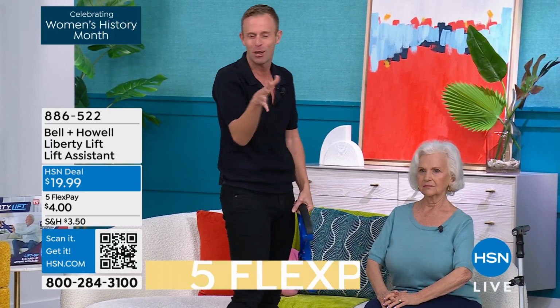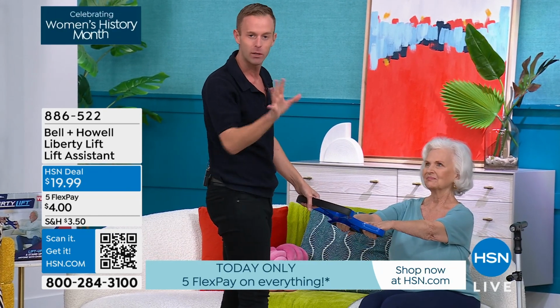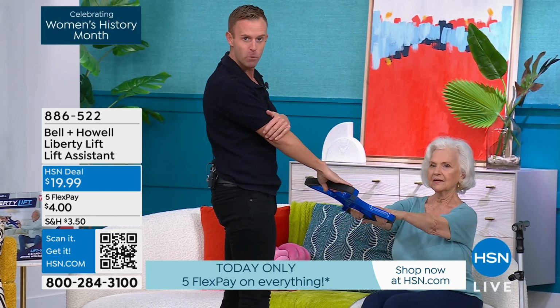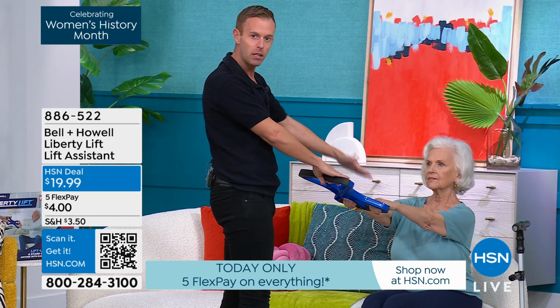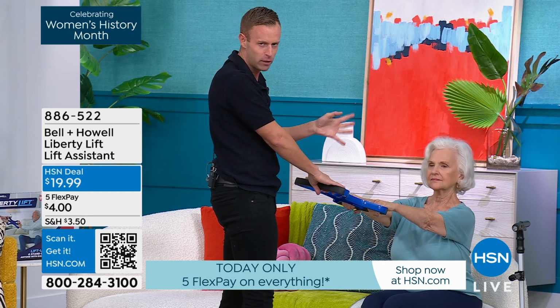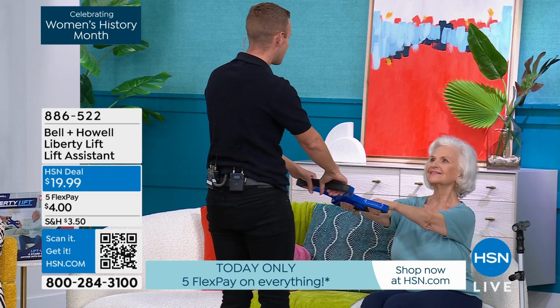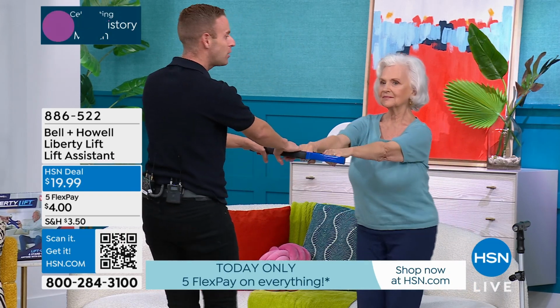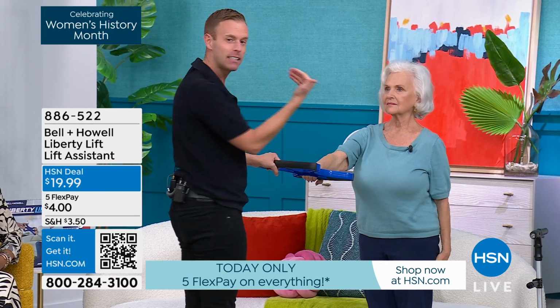I'm going to turn my back towards you because I want to show you in real life. But Patsy's done this lots. She can get up off the couch just fine, but we're going to pretend for TV. Now my arms are straight and Patsy's arms are straight, and this is an inclined plane. So it's taking all the weight off of me and all the weight off of Patsy. We don't feel anything, but I do give her a countdown so she doesn't come flying. So 3, 2, 1. I take 2 steps back. Sometimes it's just 1 step depending on the height, and Patsy comes right up off the couch.